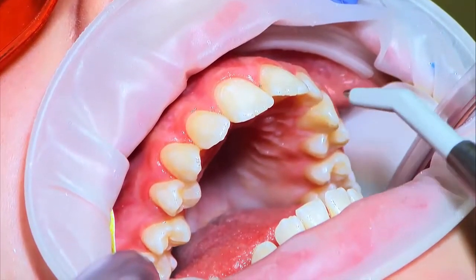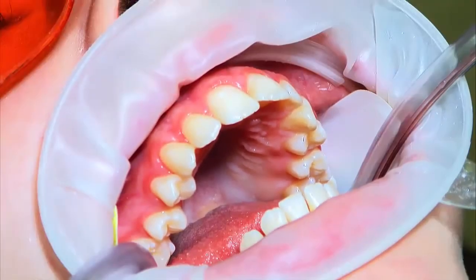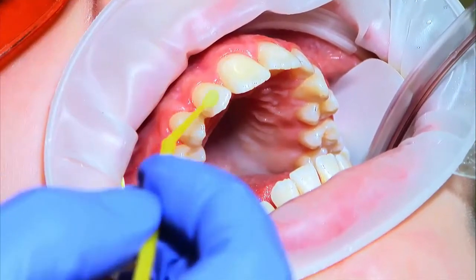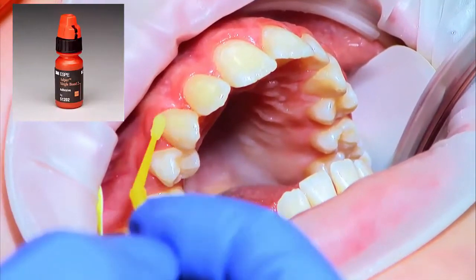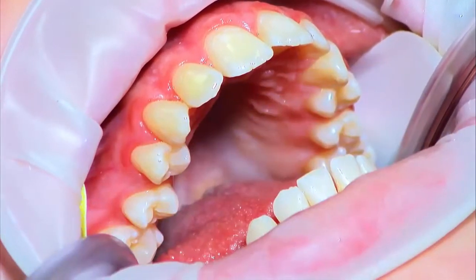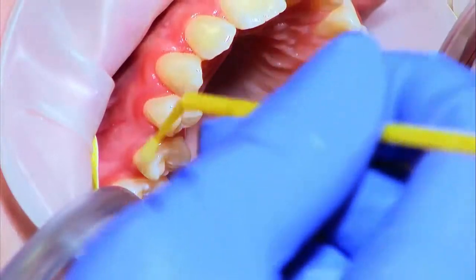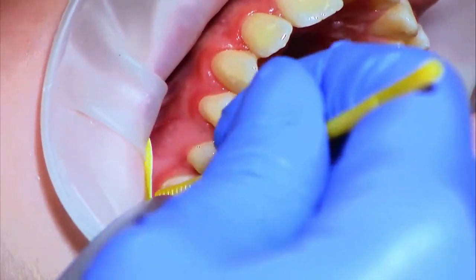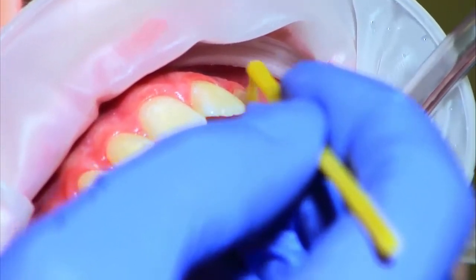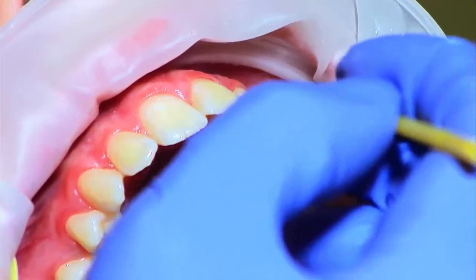Please do not use the air from the air-water syringe, because tiny particles of water and oil from the instrument can potentially contaminate the teeth. At this point, you are ready to place the bonding agent. Use a microbrush to dab each tooth with 3M Adper Single Bond or a similar material. After 3 to 4 teeth, reapply the agent and repeat. Apply the agent gently to prevent damage to the enamel rods — following etching, the rods are fragile. Use a gentle dabbing motion and avoid long dragging motions, especially near the gums, to prevent saliva contamination.